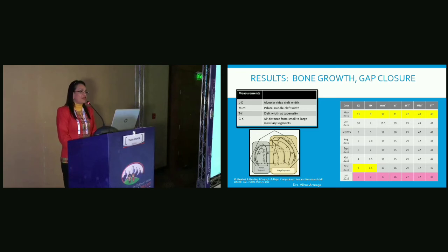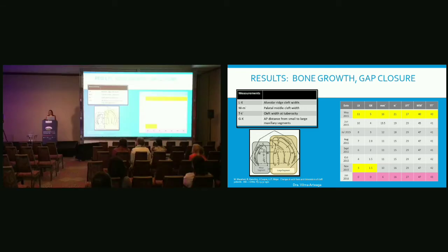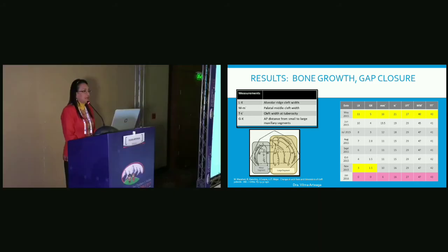One of the most difficult things about this technique is that sometimes they say that the maxilla is collapsed and it won't grow. But with our technique, that's not true, because we're changing the plates every month and we accompany the growth of the baby.